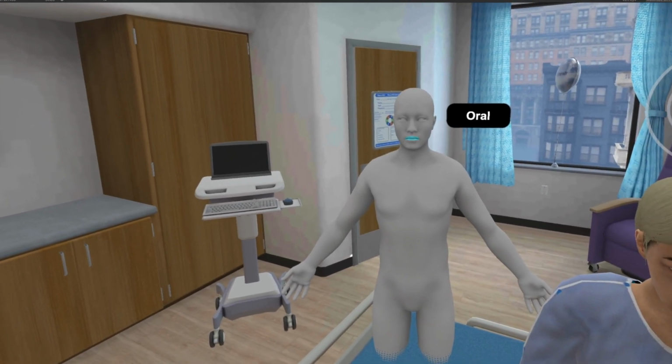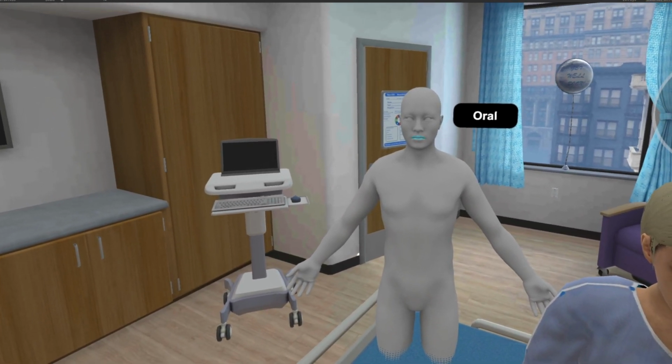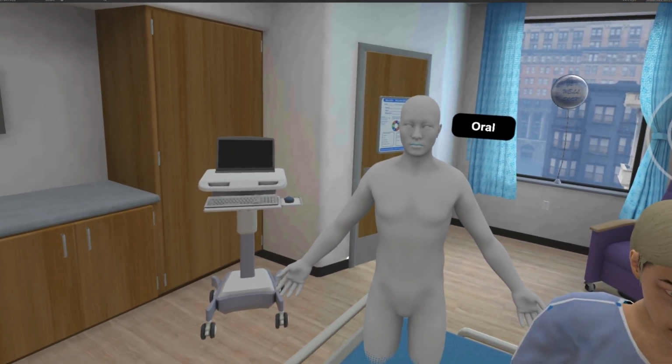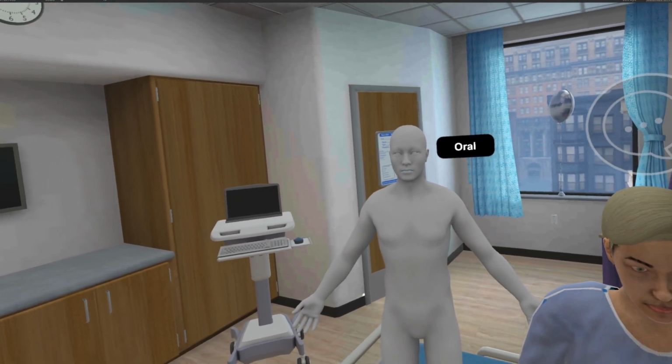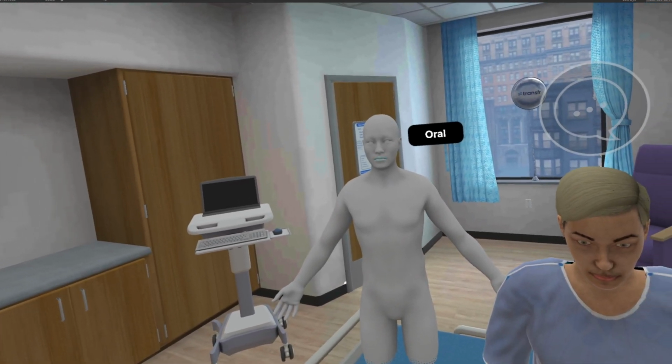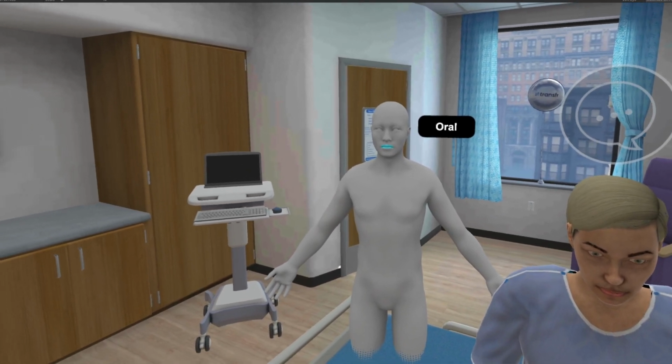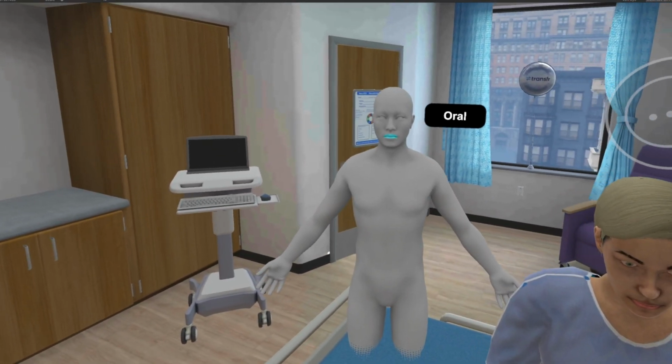For instance, you would use a different method if your patient was coughing, unable to close their mouth for an extended period of time, unconscious, or heavily sedated. Food, water, and oral care can affect mouth temperature. Before taking a measurement, ask Carla if she's had any of those in the last 15 minutes.